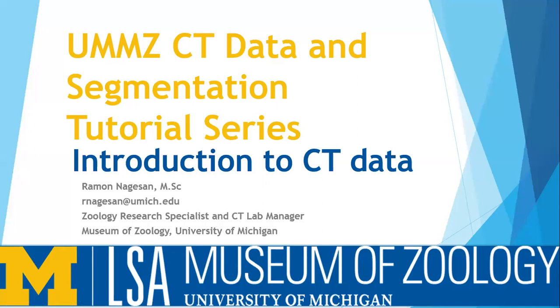We're going to do a short introduction to what CT data is. This video will only be about 4 or 5 minutes long. We're not really going to go into any segmentation or anything like that. We're just going to talk about some files.